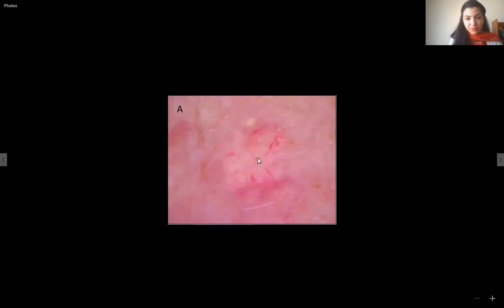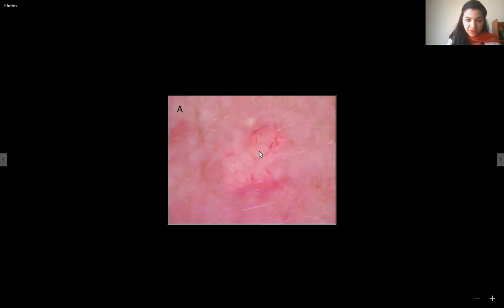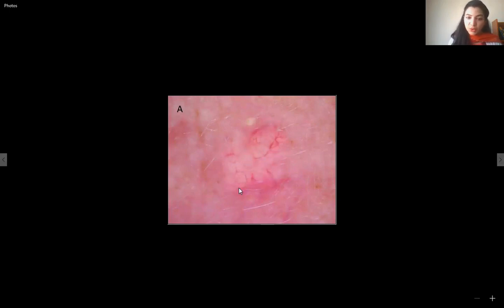Now this lesion is very important to discuss. There are yellowish clods in the background, with whitish-yellow cheesy material visible, overlying which are vessels — but they are not in focus. The vessels appear fuzzy, interrupted, and not continuous. The branches are not very visible, and they seem to avoid the center, being seen better at the periphery rather than traversing through the center. This one is sebaceous hyperplasia, not a BCC.